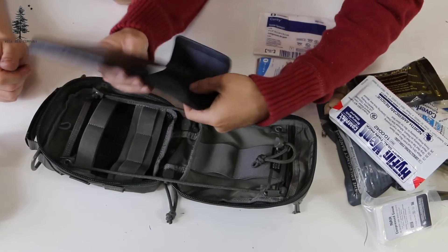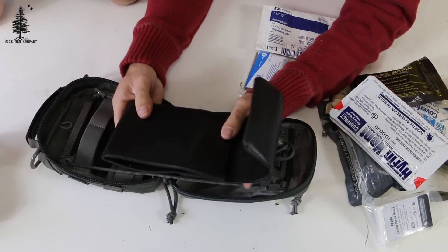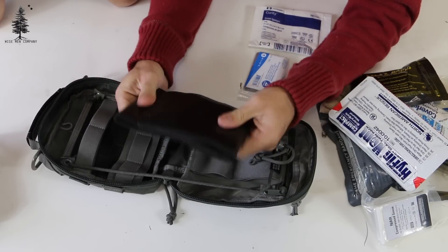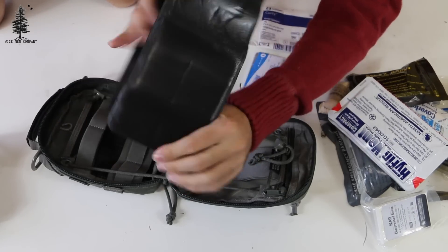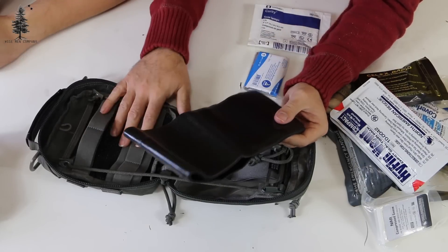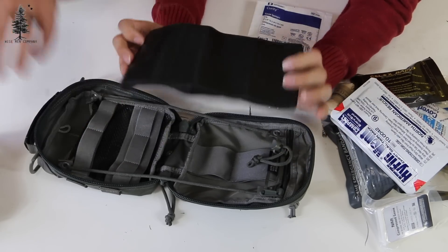This is a splint. Some of you may have heard of what's called a SAM splint — this is the same concept. It's essentially a piece of aluminum backed with foam, and you can shape this around an ankle, a leg, or an arm. This is actually really handy to have in a first aid kit and not a lot of people have that. That's one of the things about WHT that is sort of unique — you don't see this in a lot of med kits out there, and it is something I do recommend.